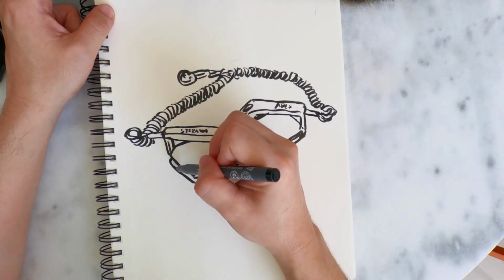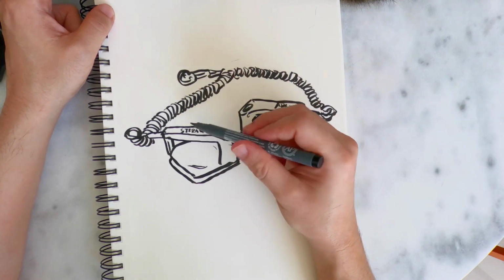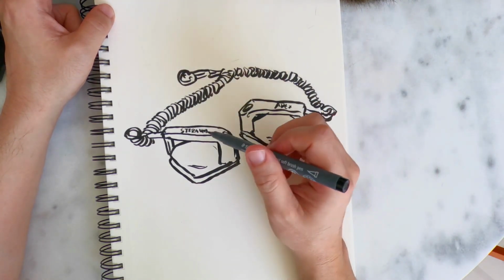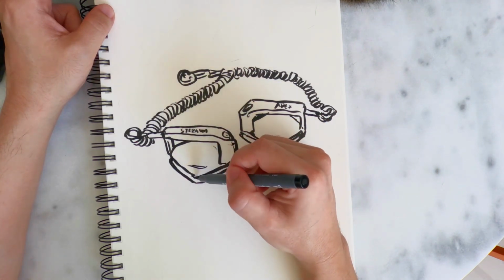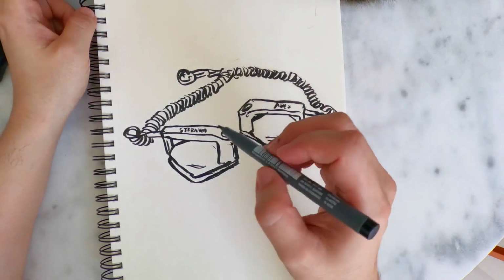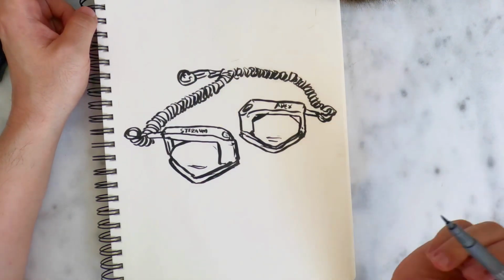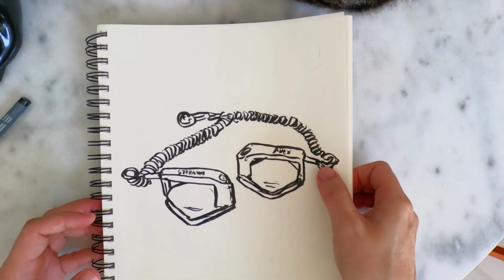If we look at the patient and think about where the heart is, it is located in the center. We should place one pad on the right side, remembering to find the area near the clavicle, and place the other pad on the left side of the chest, just below the nipple. For the general public who are not medical personnel or basic life support providers using an AED, they should follow the instructions attached to the device. I hope this information is somewhat helpful.